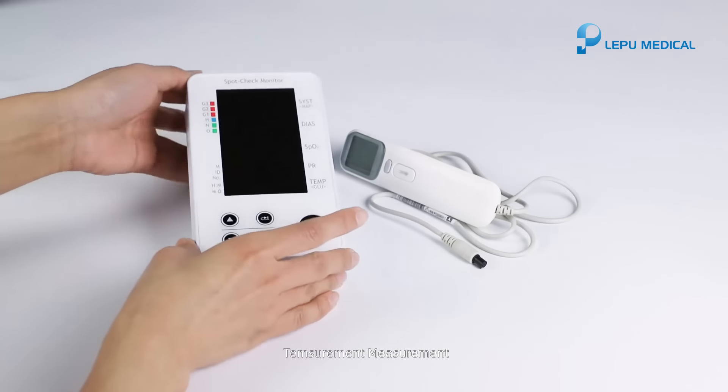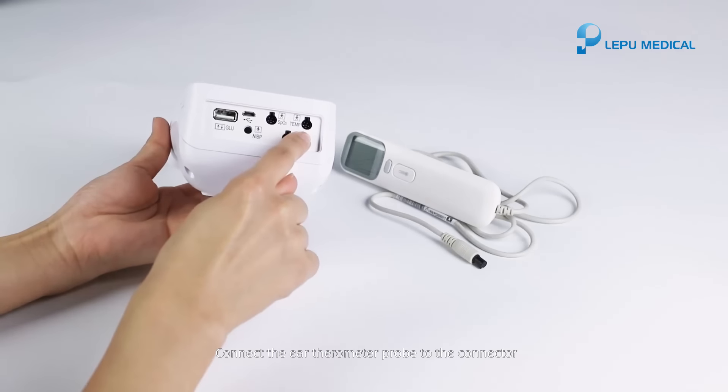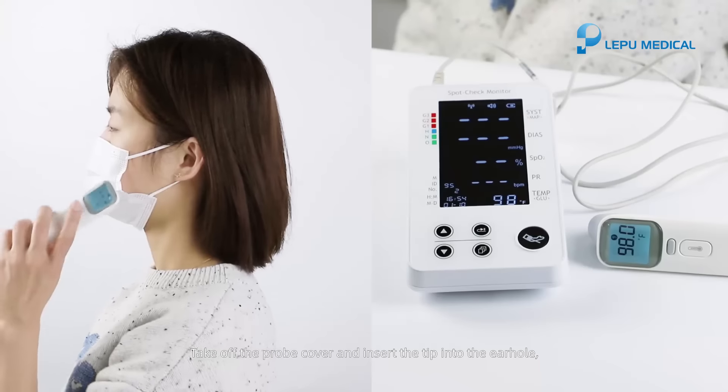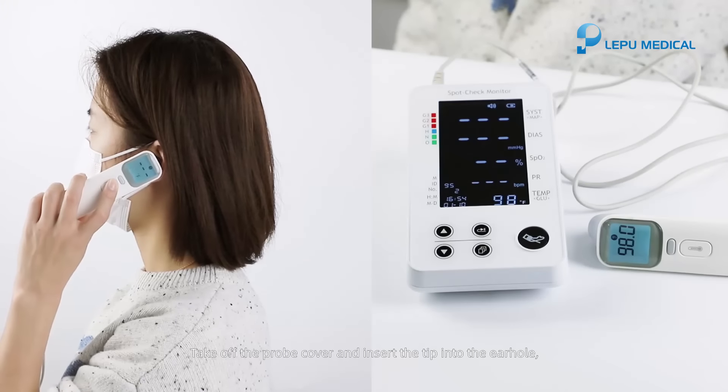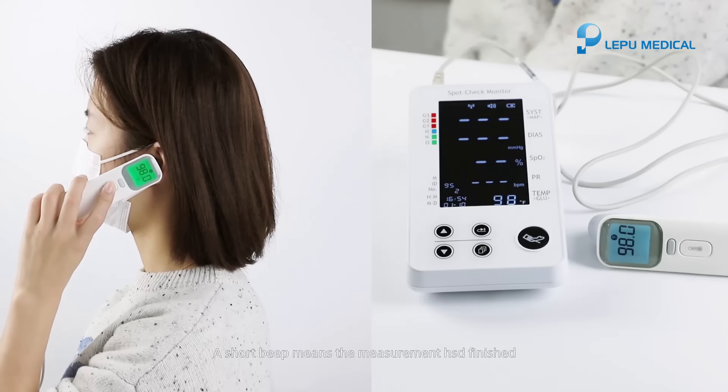Temperature measurement. Connect the ear thermometer probe to the connector. Take off the probe cover and insert the tip into the ear hole. Press the measuring key to take a measurement. A short beep means the measurement has finished.